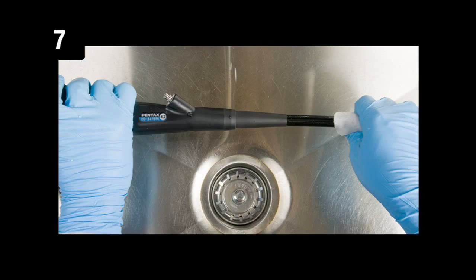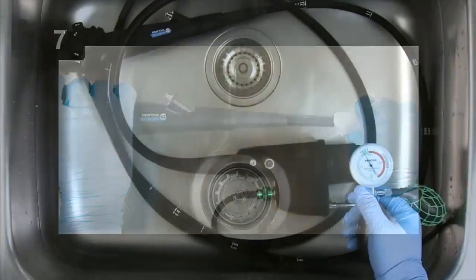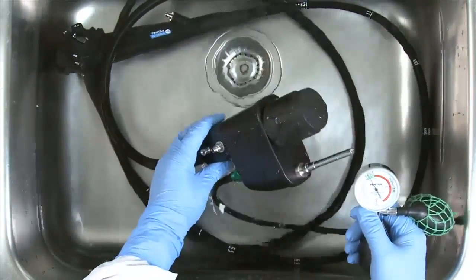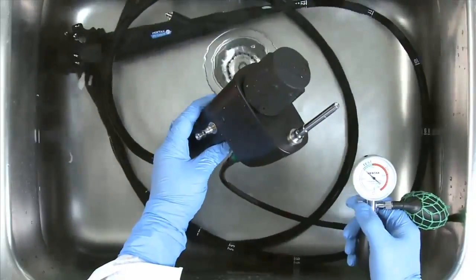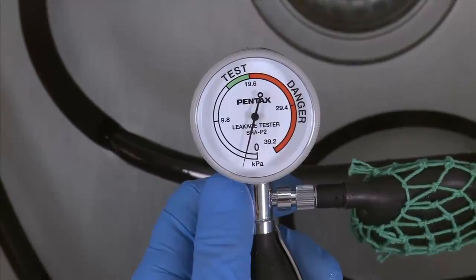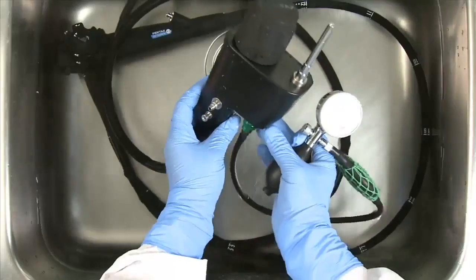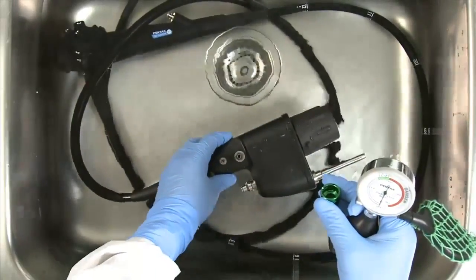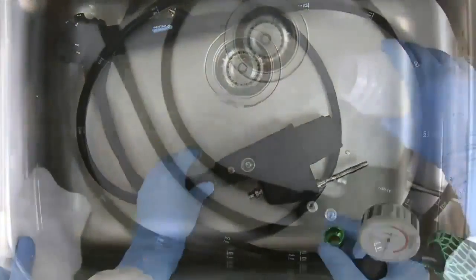Step 7. Prepare to manually clean. If no leak has been detected in the endoscope, remove the PVE connector from the water and turn the pressure relief valve counterclockwise until the gauge needle returns to 0. Remove the leakage tester from the venting connector and place the PVE connector back into the sink.